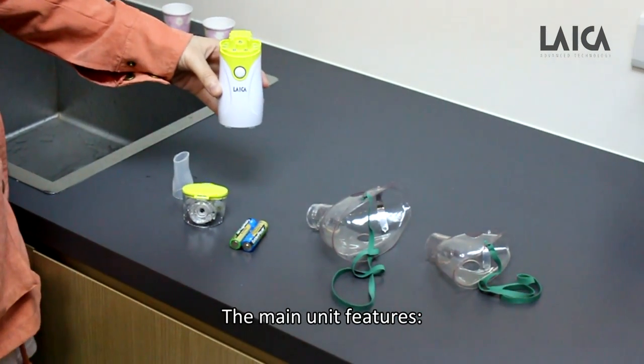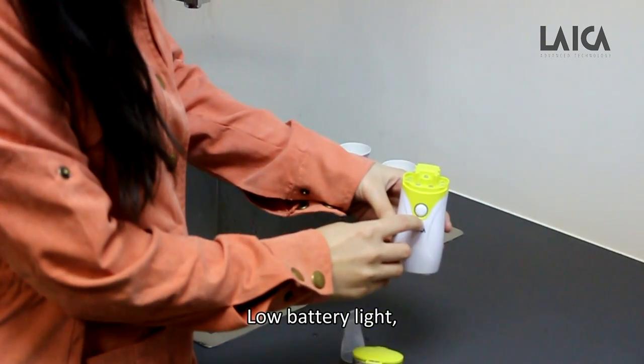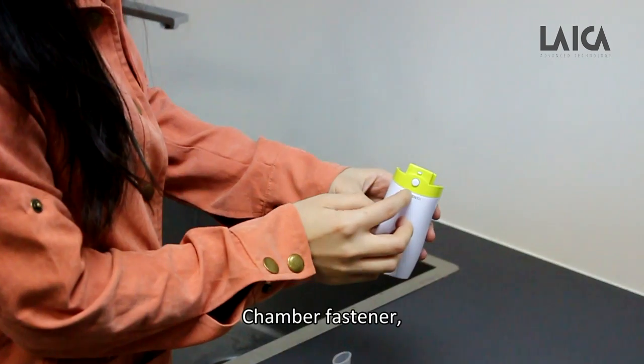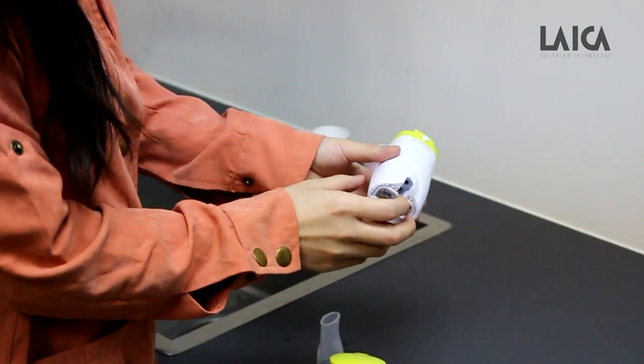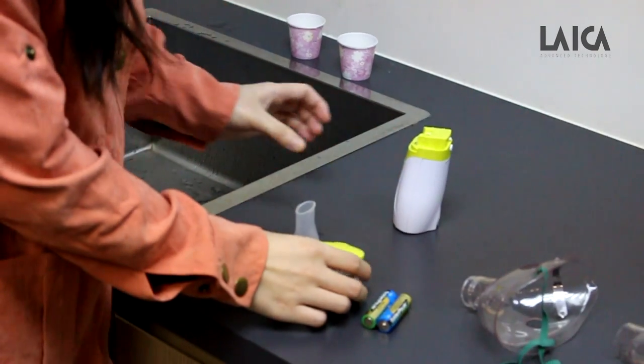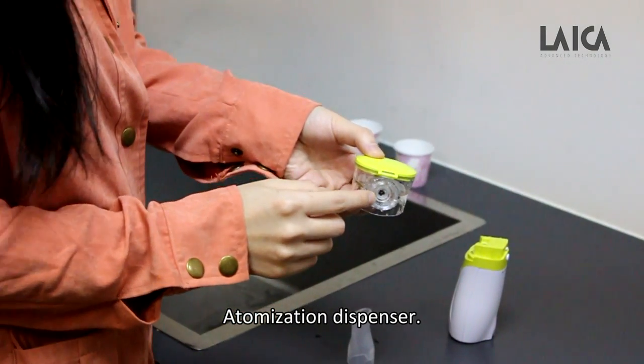The main unit features an on and off button, low battery light, chamber fastener, battery compartment, atomization chamber, and atomization dispenser.